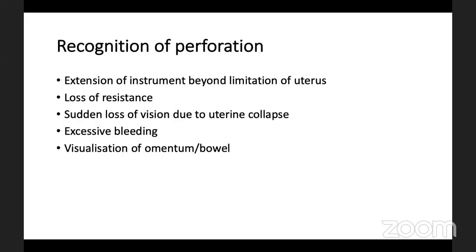And then there are also some media-related complications. These ones I discussed during another workshop. Gas embolism, fluid overload, electrolyte derangement. We will not go into details about these today. So how do you recognize a perforation when you're doing hysteroscopy?